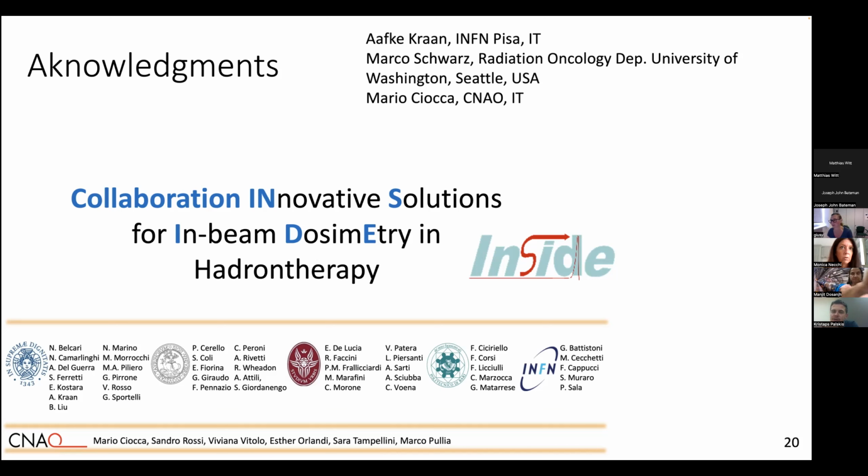No, online PET is not absolutely sufficient, because multi-parametric imaging in pre-treatment is important in many aspects. It is used to precisely calculate the dose to perform the treatment planning calculation, and then also to calculate the parameters that are used for modeling of the efficacy of the treatment. So I think that we cannot renounce the standard high performance imaging systems to improve particle therapy quality.